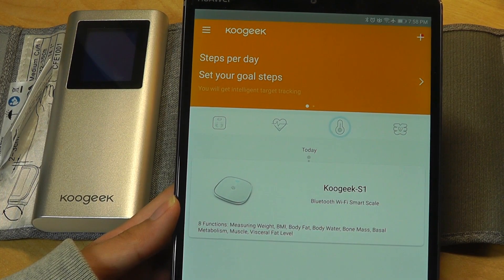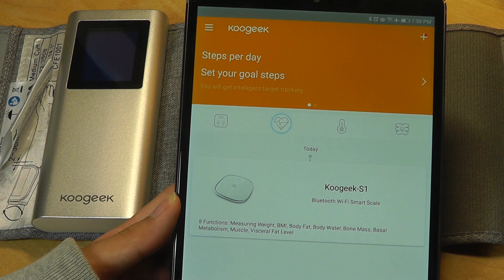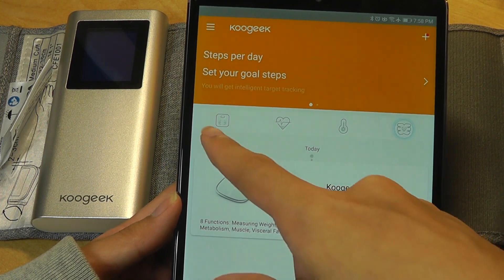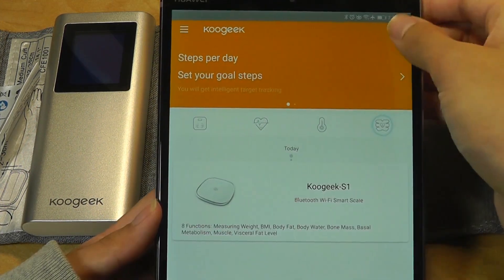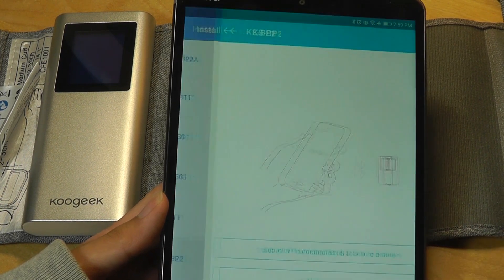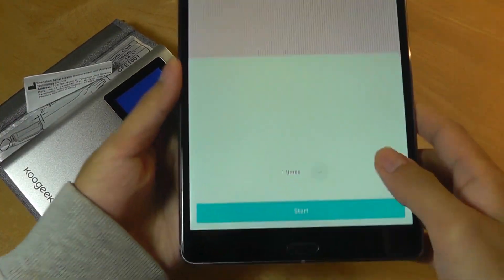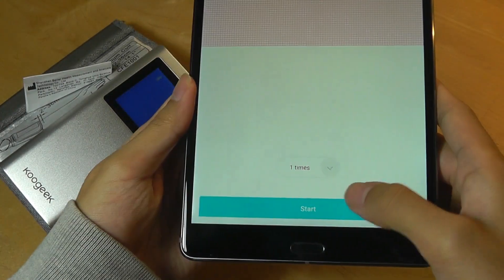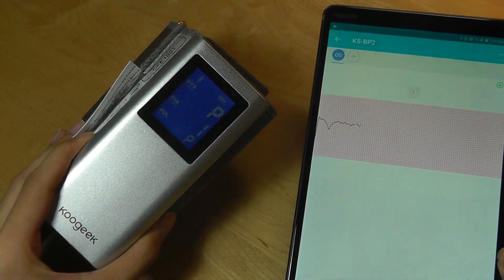The app is pretty simple. You do need to sign up with an email the first time, just to encrypt your data and protect the statistics stored on your account. From here you can see a number of their devices to connect to, and a few advertisements such as for their smart scale. You can tap the plus key to add a new device — in this case the BP2, the blood pressure monitor. Once the connection is done, you're able to start the measurement. Just turn on the device, select the number of times you want to measure, and tap start from your phone or tablet and it will automatically begin on the device.